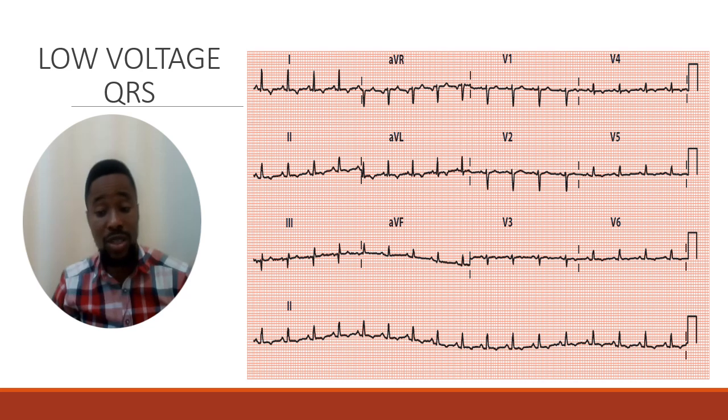So it's not going to be 0.04 seconds anymore because now 50 millimeter equals 1 second. So you just figure those mathematics, use the formula. That's why in the beginning I taught you how they calculated that.